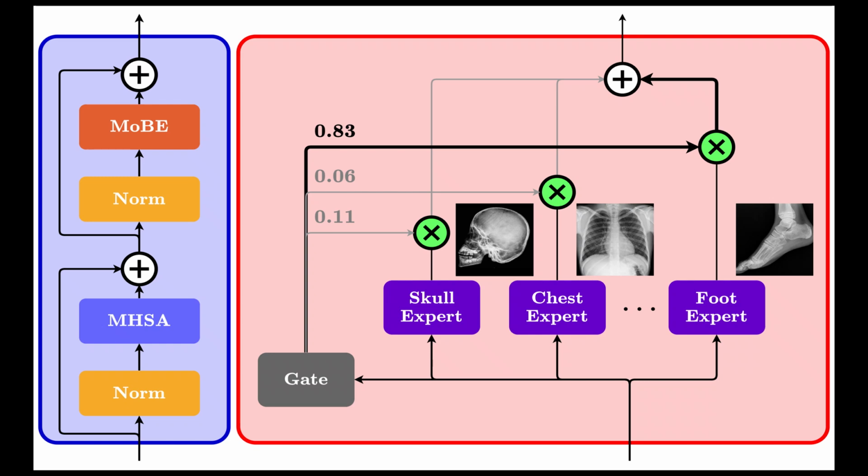Medical AI has gotten really good at reading X-rays. But here's the catch. Almost all of it was built for adults. When you feed a child's X-ray into these models, performance drops off a cliff. Why? Because children are not small adults. And today's paper, PedCLIP, fixes that.